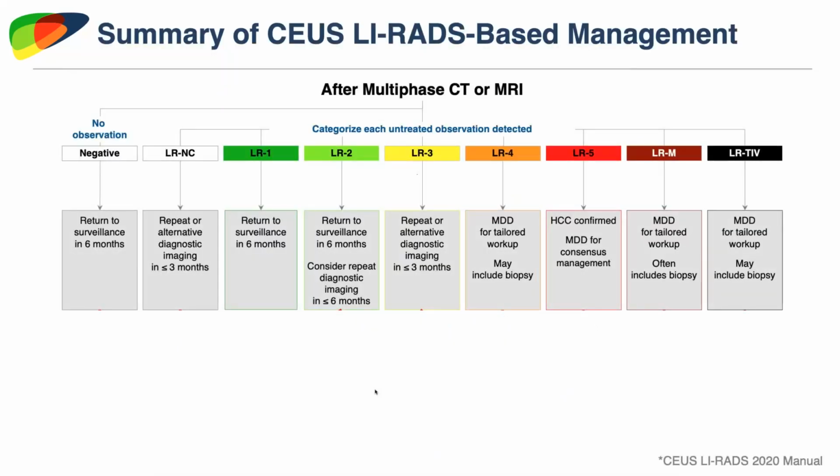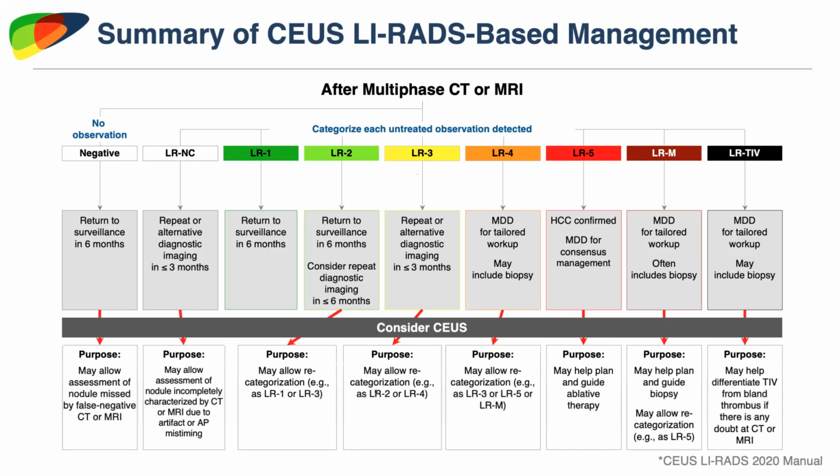So in this algorithm, after a multi-phase CT or MRI, depending on what the observation is categorized as, there are a host of various applications for contrast-enhanced ultrasound.